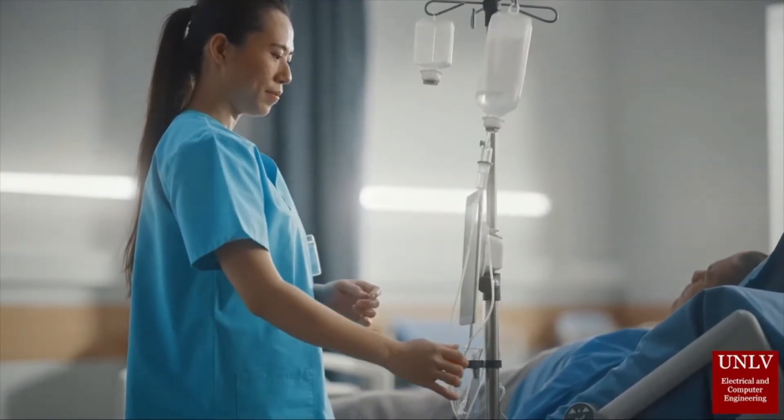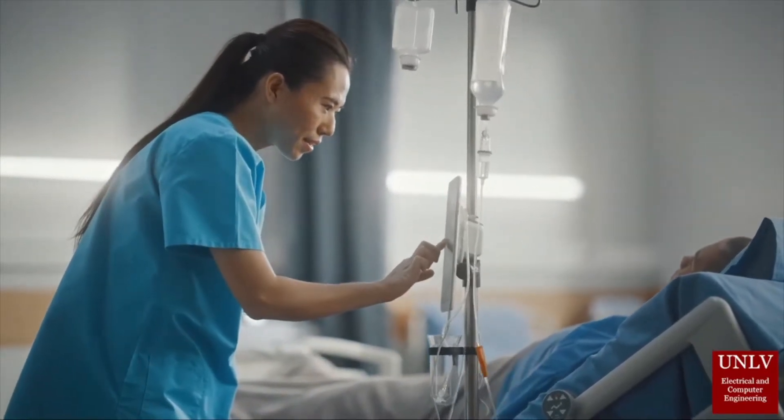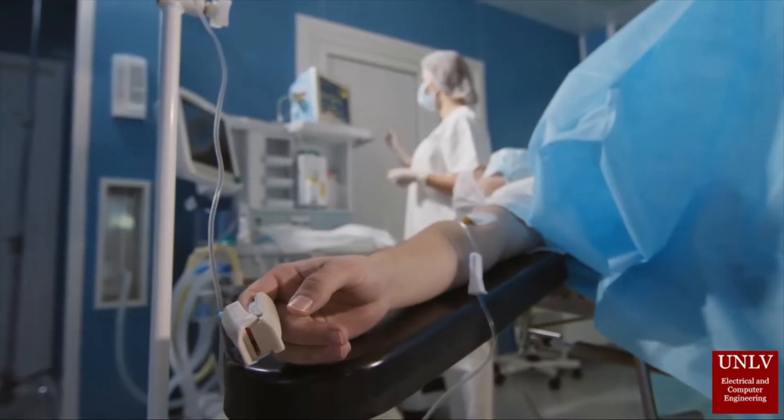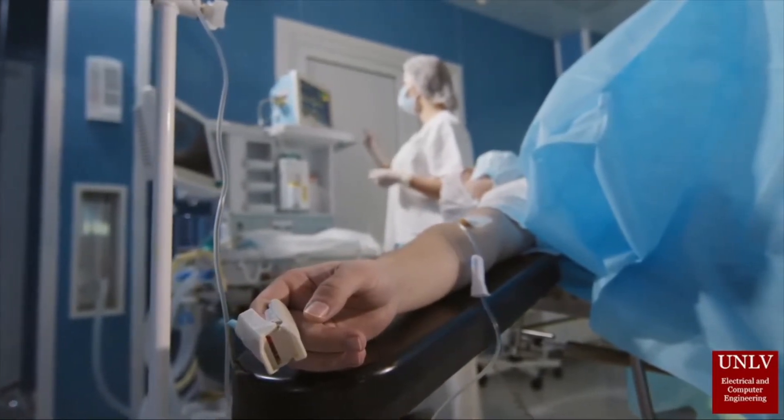The device also reduces the risk of repetitive motion injuries and increases the overall safety of patients. The goal of IFDAMS is not only to bring essential advancements to current designs, but to provide much-needed affordability in an industry saturated with high price tags.